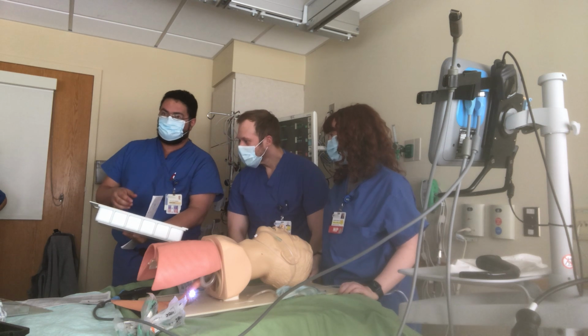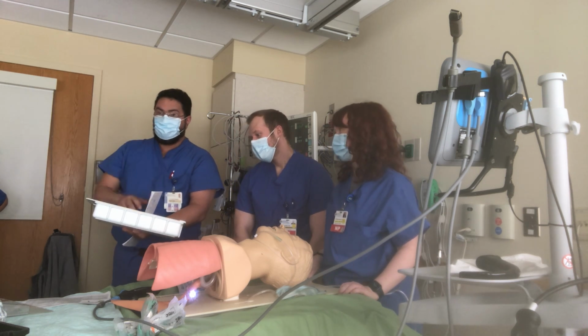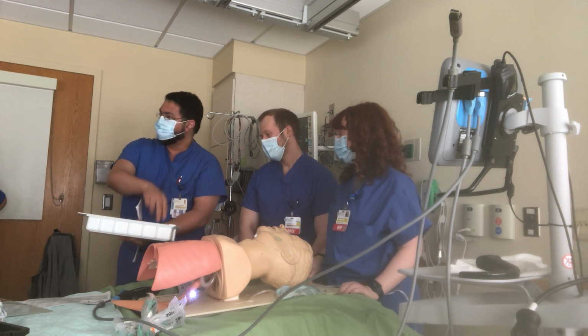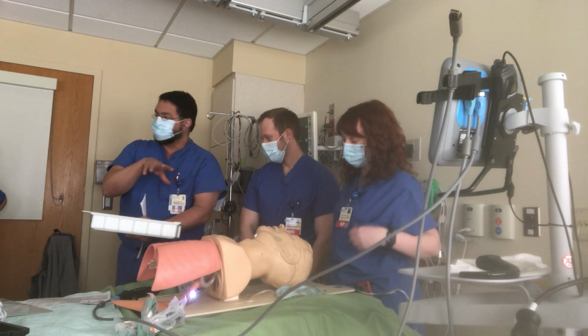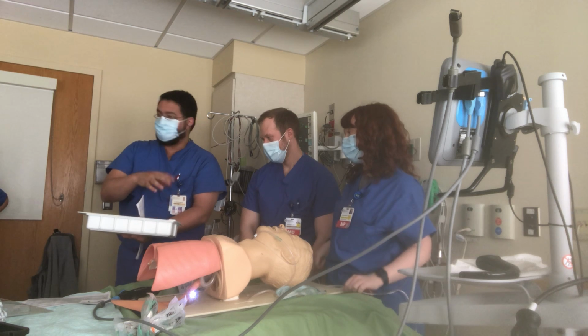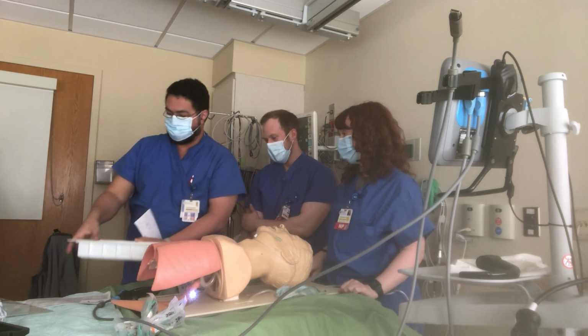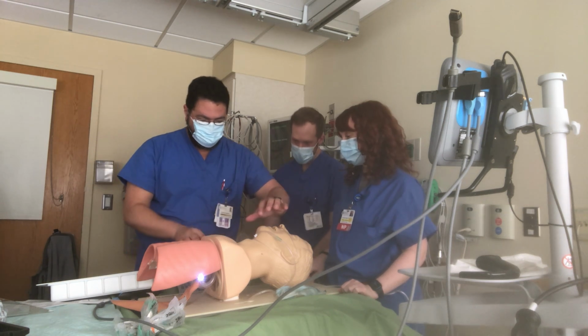The first thing to start with. Do you have the app? Yeah, open the app, please. First thing to start with. So I always say this takes about 20 minutes, maybe 15 or something. I can do it quicker if the anesthesiologist is there and they can do a block. So I can do a quick block here.